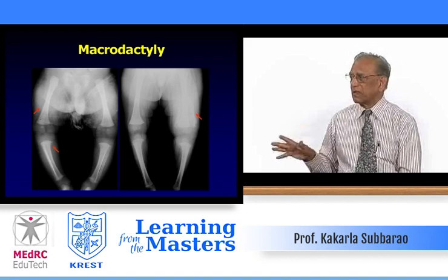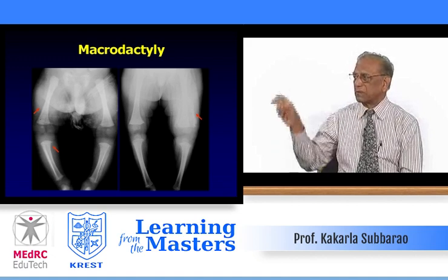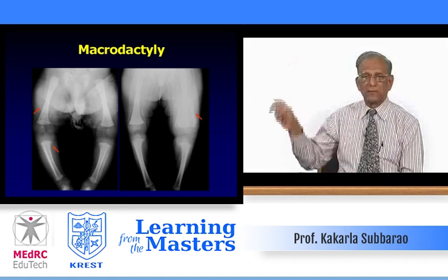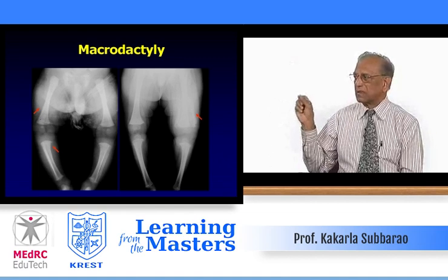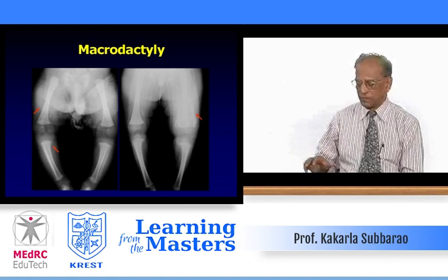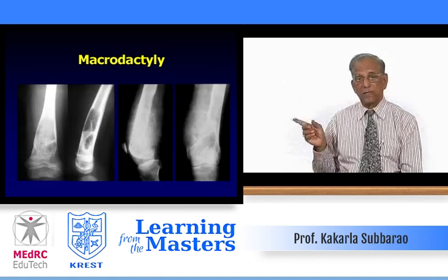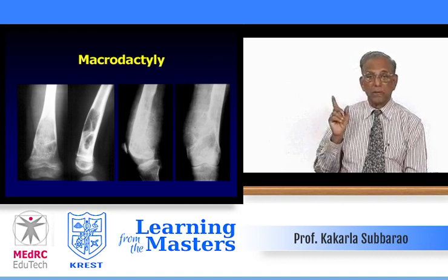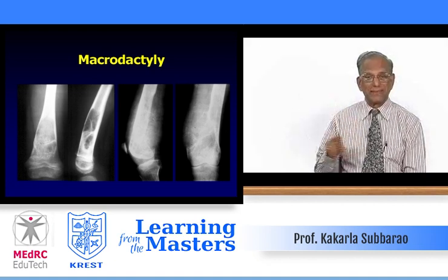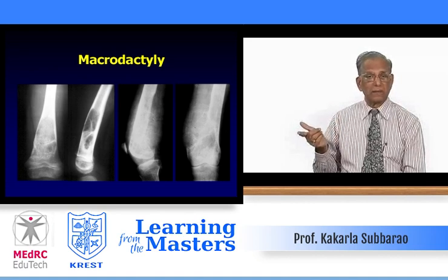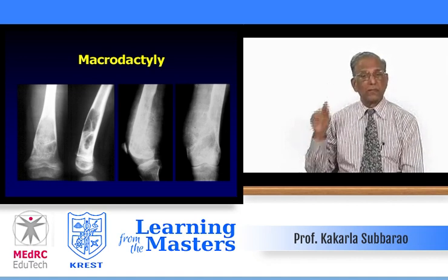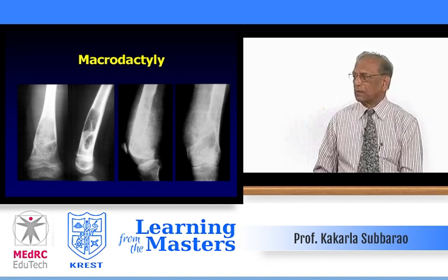On the right side, there is a subperiosteal hematoma extending along the shaft of the femur. If you look at the epiphyses, there are ring-like epiphyses. This is scurvy with subperiosteal hematoma. With scurvy, one must differentiate from parent abuse — the battered child — where there are multiple fractures or healing fractures, fresh fractures, bilateral and possibly asymmetrical because the child is beaten at different times.